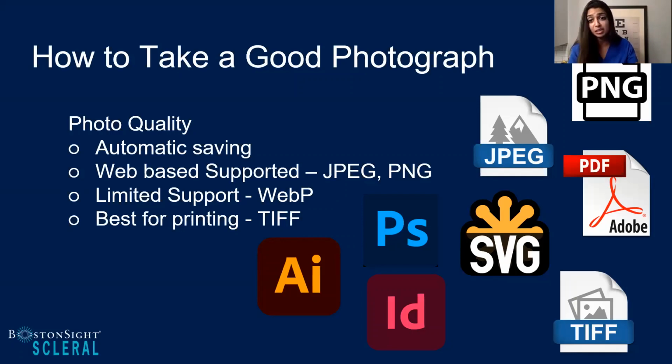I think for printing purposes or lecturing purposes also, TIFF files are beautiful because of the clarity and the contrast of the colors. But really, I think the moral of this slide is to understand what image size is going to work best. Try to keep it consistent also when you're comparing different images. And third, make sure you know how to access your images, because the last thing you want is to share these images and then there you go, you lost a file and now it's corrupted.